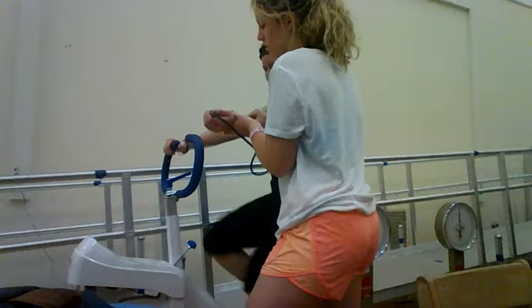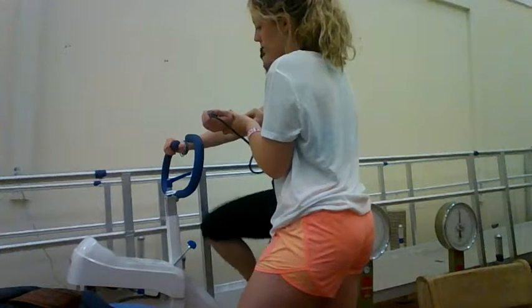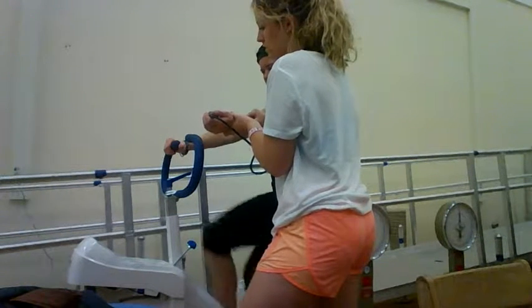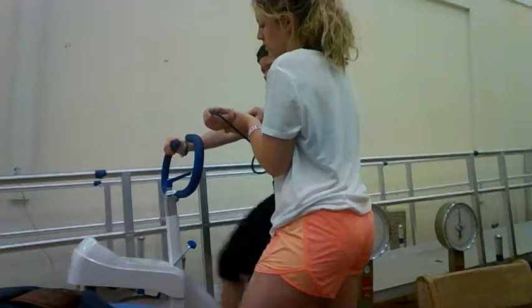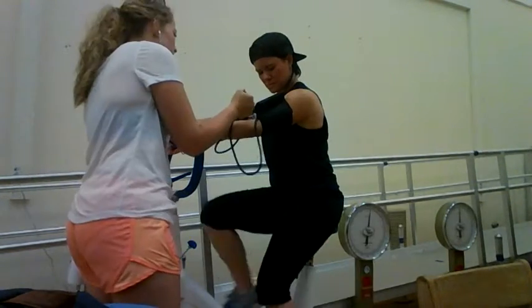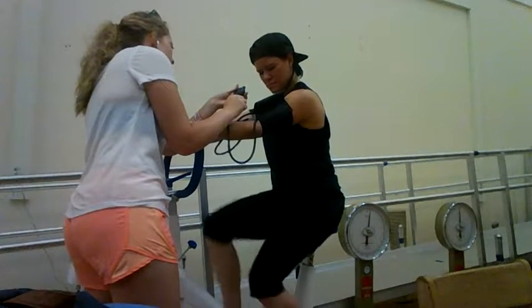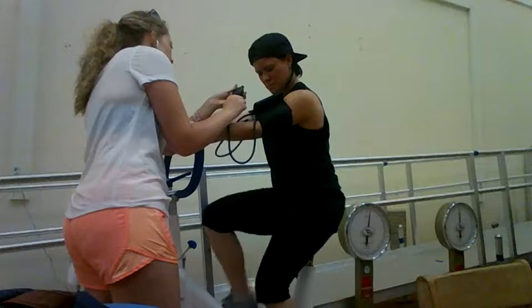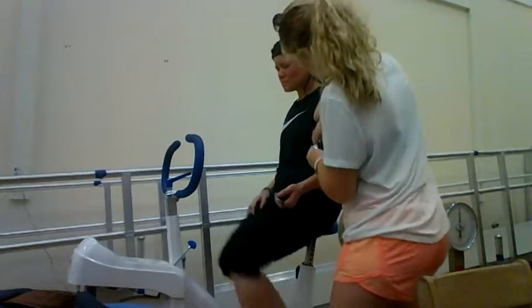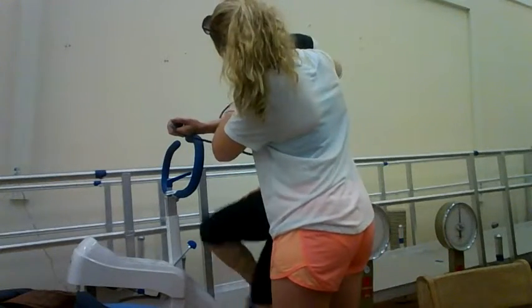The subject's heart rate is being recorded every minute throughout this exercise. Blood pressure and RPEs are being taken at each increase, right before each increase in kilopond workload. We are now taking a recording of the subject's blood pressure during the first minute of exercise. We have now increased the workload to 1 kilopond. This represents stage 2.